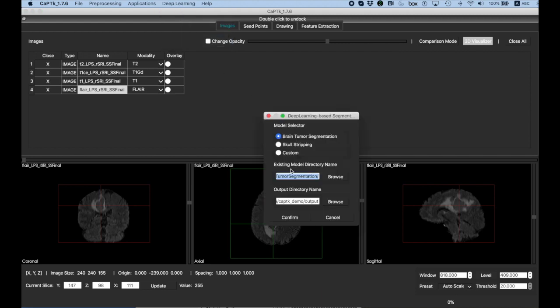And for the model, again, we're going to use the pre-trained model that comes with CapTk, which in our newest release, the model was trained on 584 subjects from multiple institutes, all registered in SRI space. The output directory goes here, and you hit confirm.